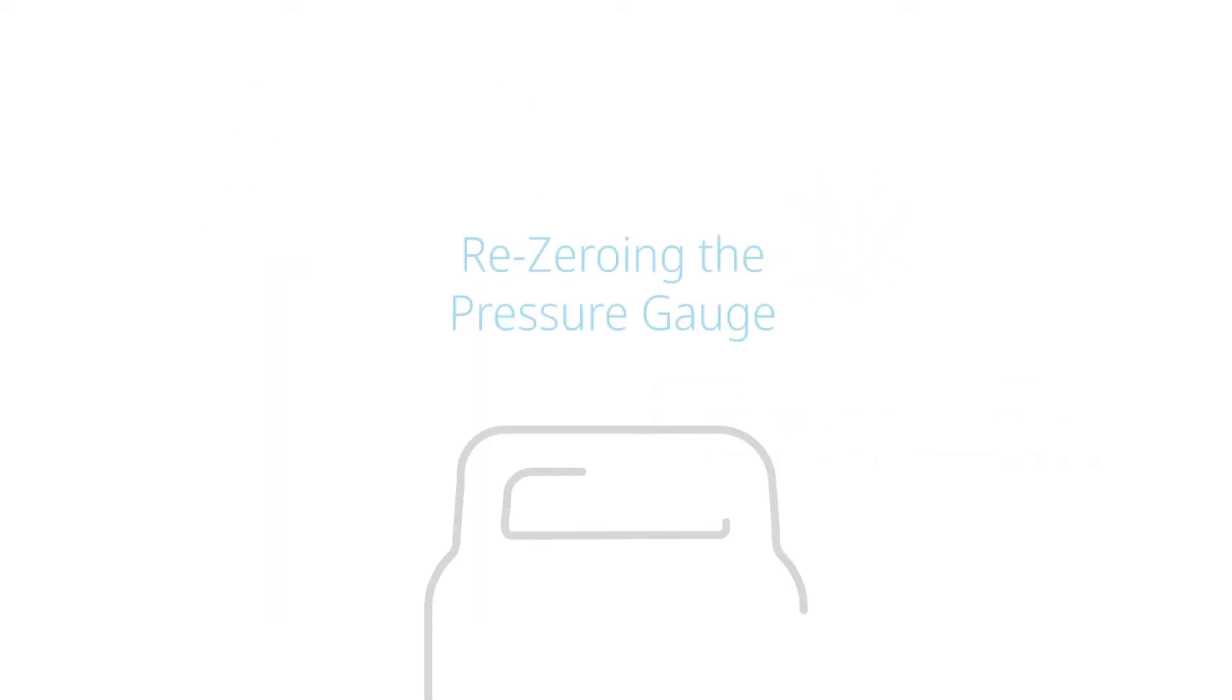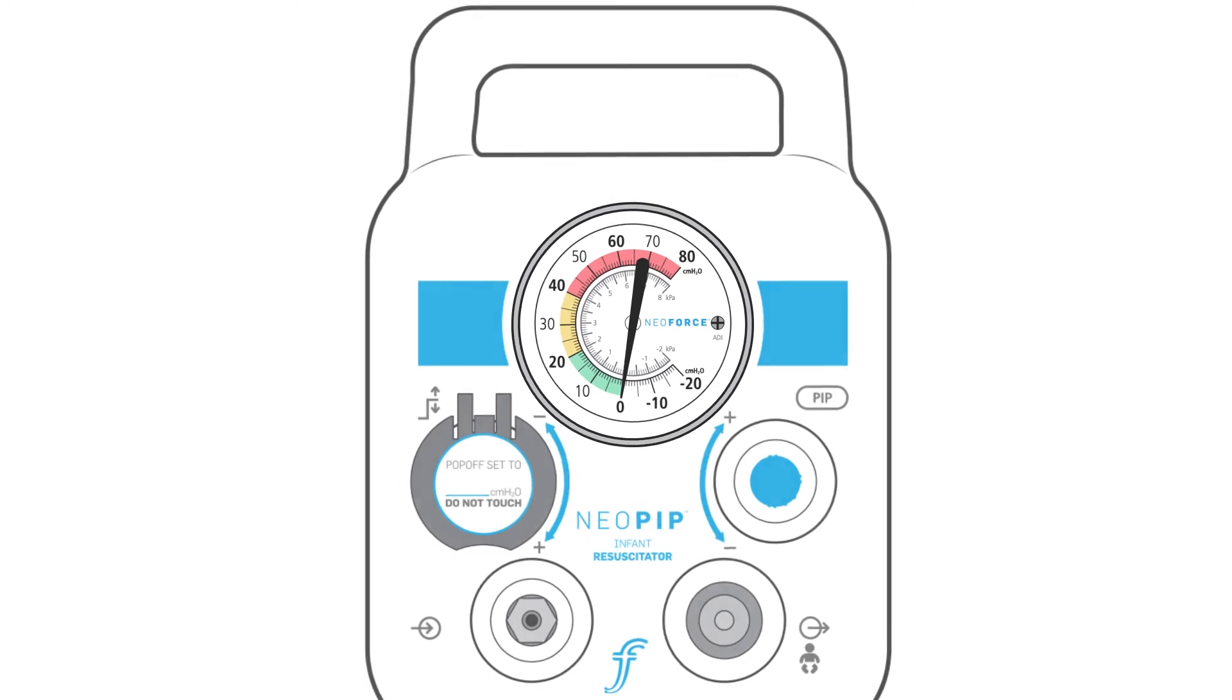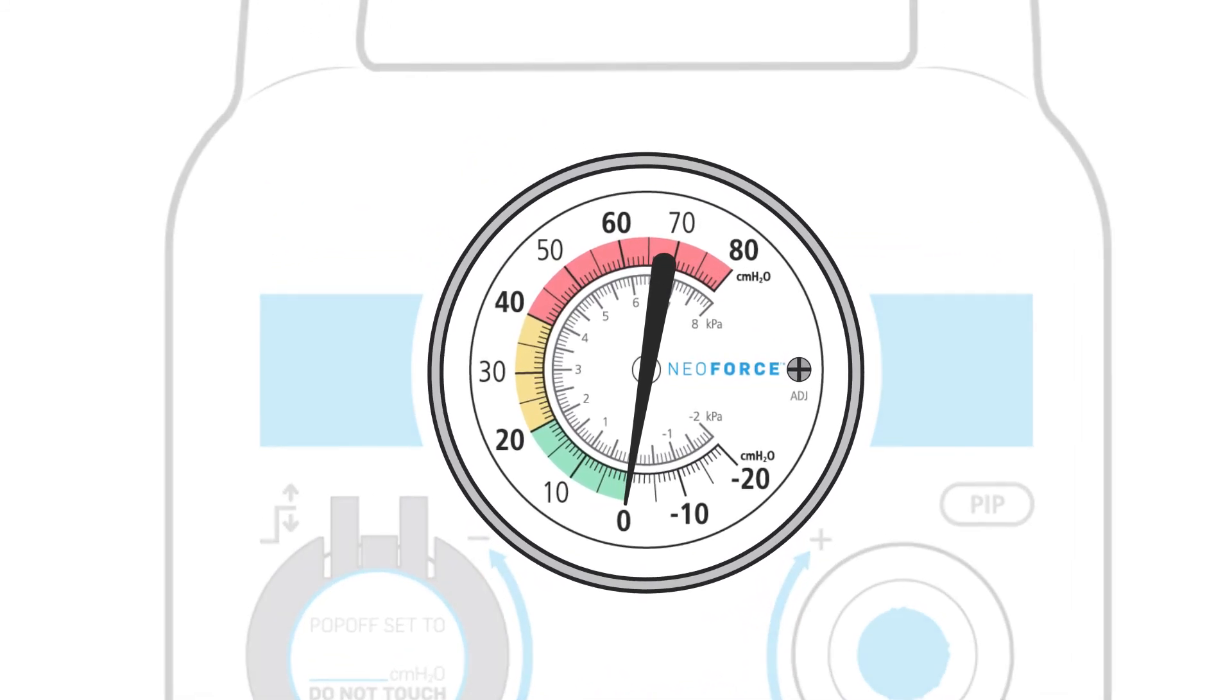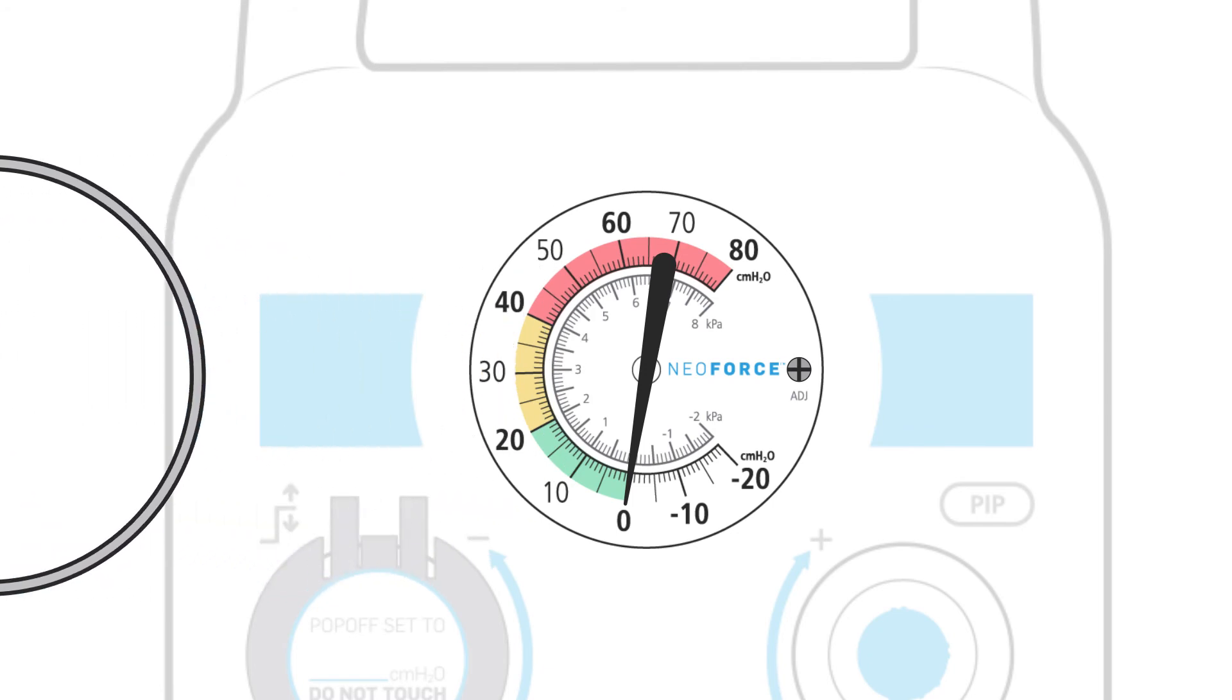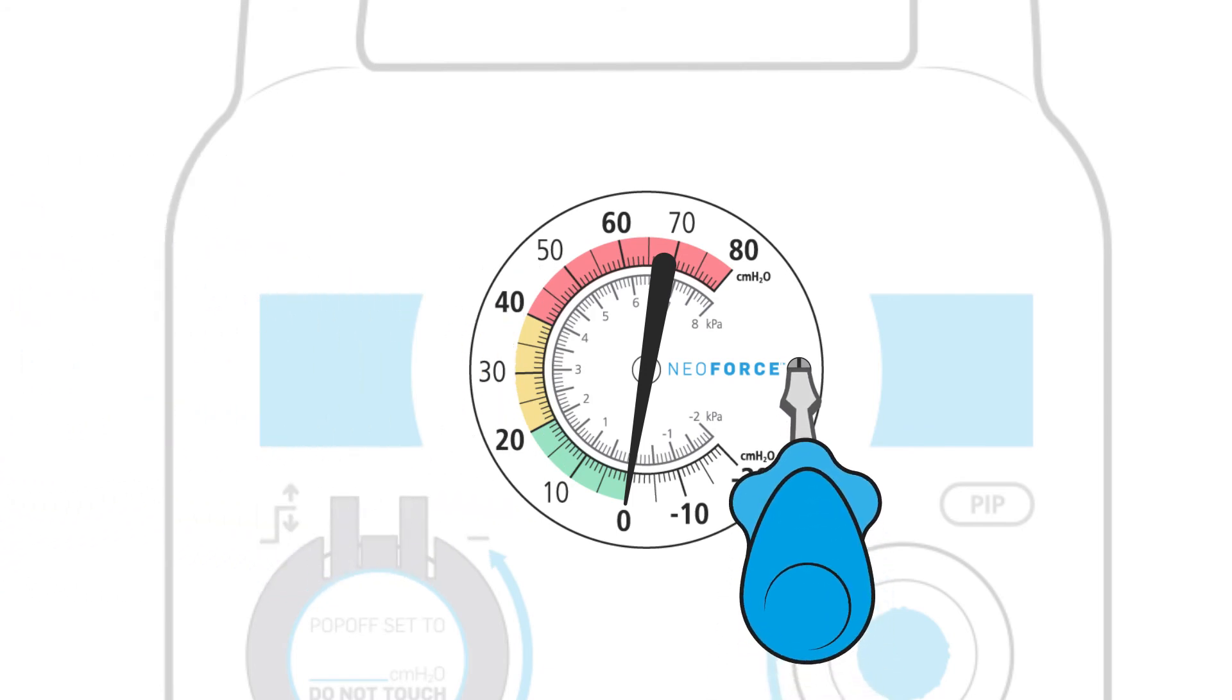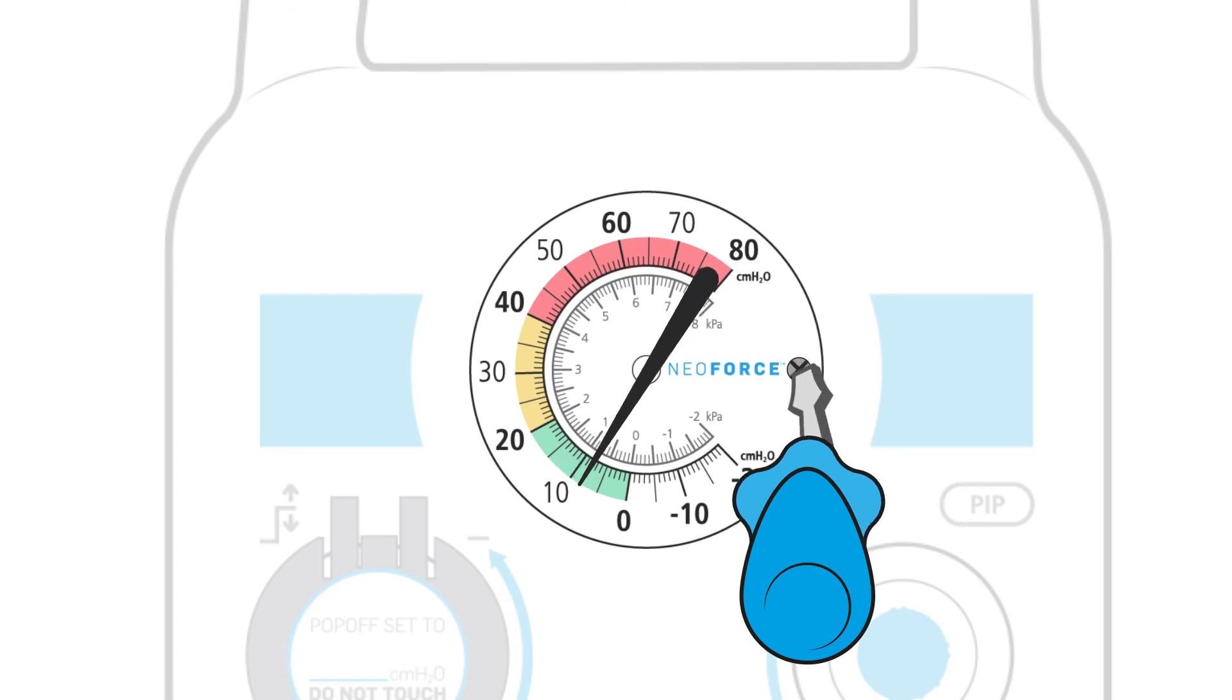Re-zeroing the pressure gauge. Place the Neopip infant resuscitator on a level surface with the gauge at eye level. Remove the gauge cover by rotating it one quarter turn counterclockwise. Using a small screwdriver, slightly turn the adjustment screw and confirm the needle is moving. Reset the needle to zero.